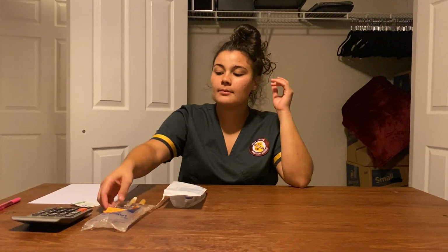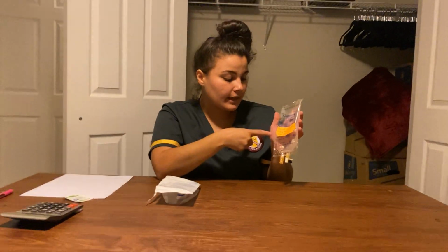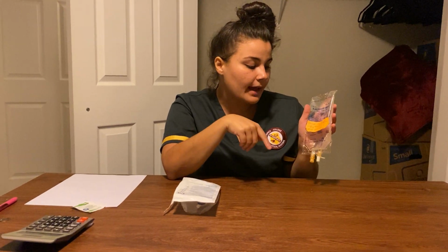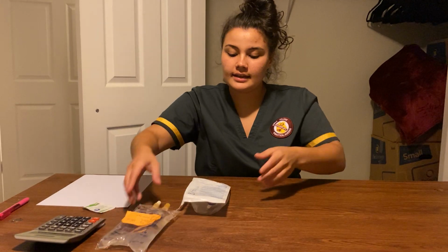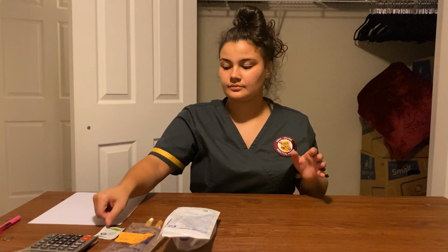After that, I'm going to gather my supplies. I'm going to gather my correct medication, and that is Ancef 1 gram, intravenously piggyback every 4 hours, infuse over 1 hour, and this is 125 milliliters. Then I have my secondary medication tubing, and this has a drop factor of 10. And also my antiseptic swab.